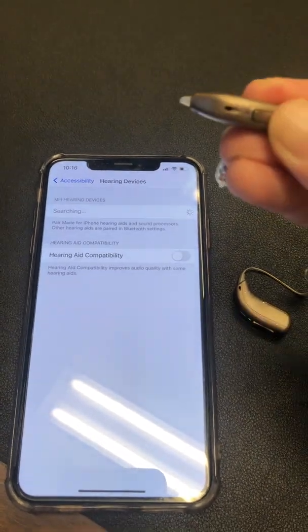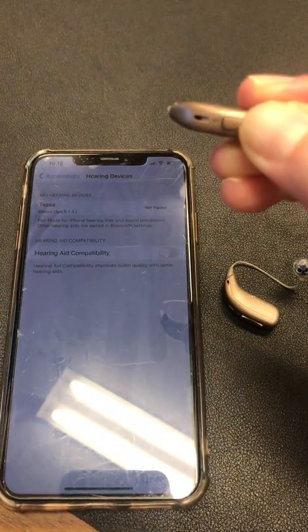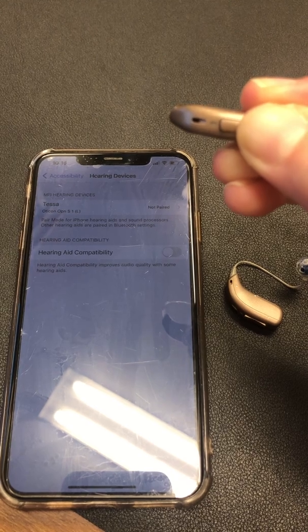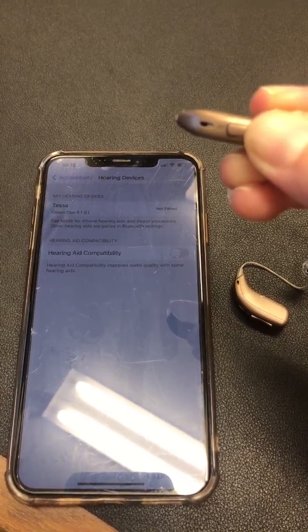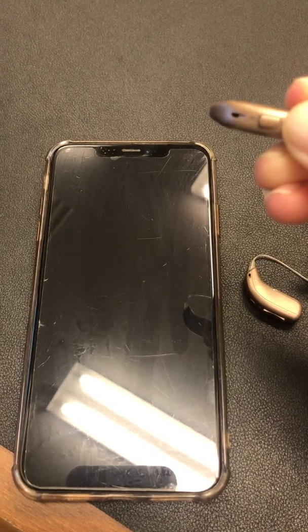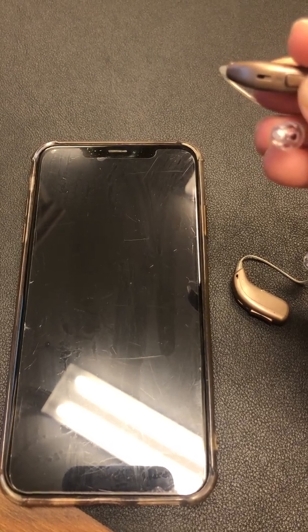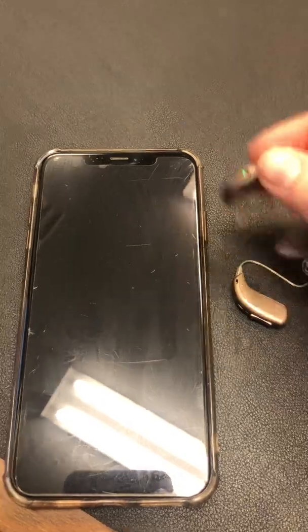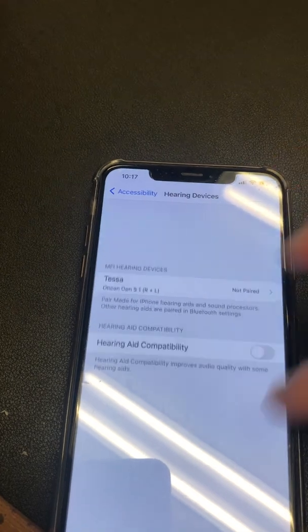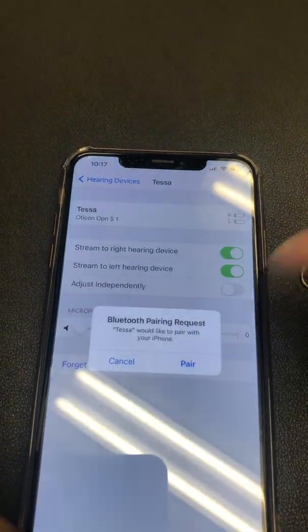It lost the right one too, so I'm going to restart the right as well so the phone can find both hearing aids. It takes a little bit longer to turn the device on than it does to turn them off — just as soon as you see the green light you'll be able to turn it on. There we go — it says right and left, and now we're going to pair.